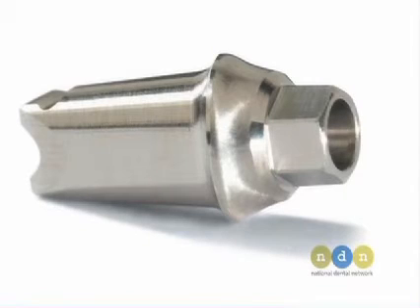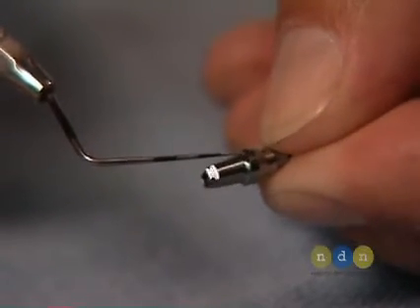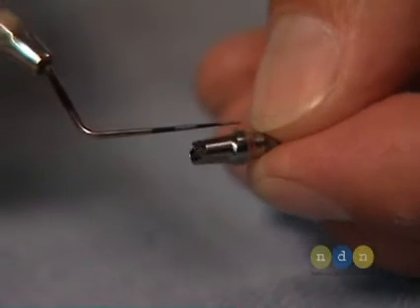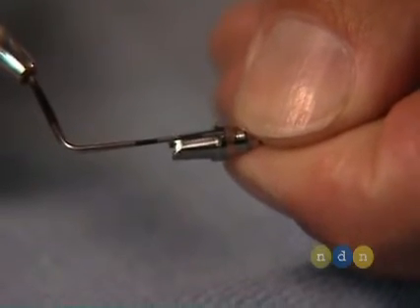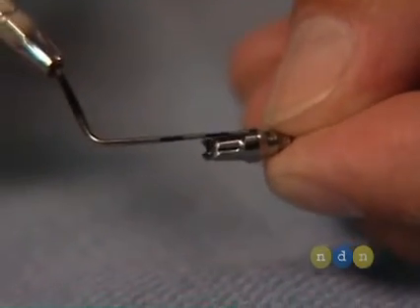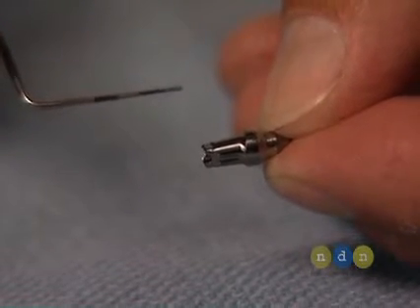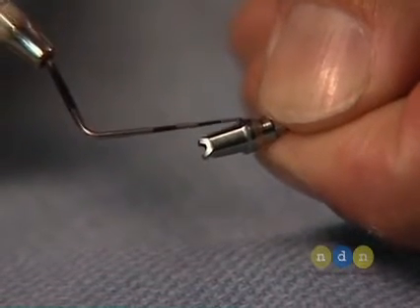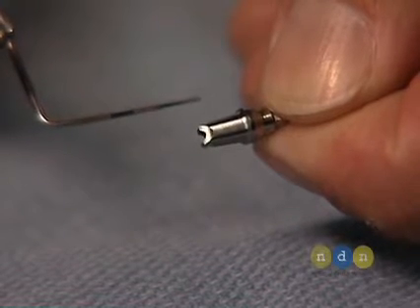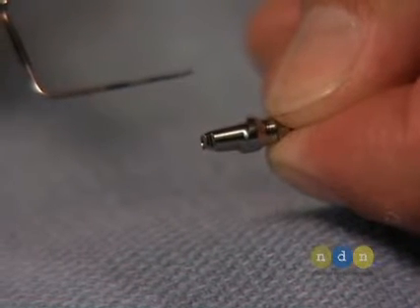As you can see here, the HexLock Contour Abutment looks very similar to a custom abutment. The collar has a variable height — the lingual portion will be higher, the facial portion will be lower, and interdentally you have a normal chamfer shape. This allows support of the papilla and provides a highly cosmetic result by minimizing the facial margin. The contours and built-in flare provide for an ideal emergence profile.